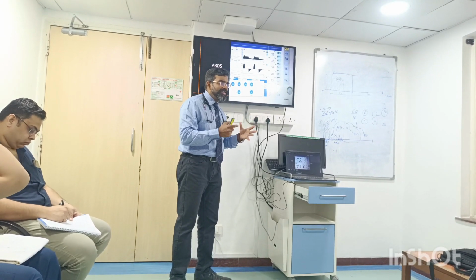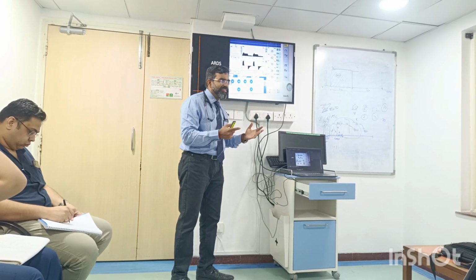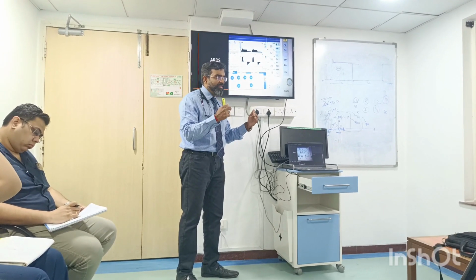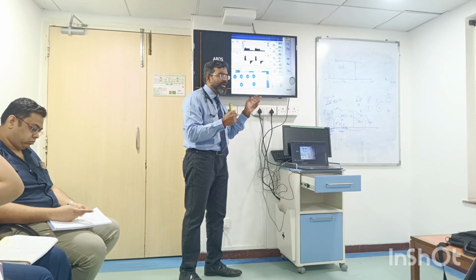Because we are not paralyzing our patients. What if he is breathing faster? Everything goes for a toss for me. I need my frequency total. Okay, I need to give him a level of sedation that makes him comfortable. If I do all these things and make him breathe at 40 when I'm giving 20, what is the point?